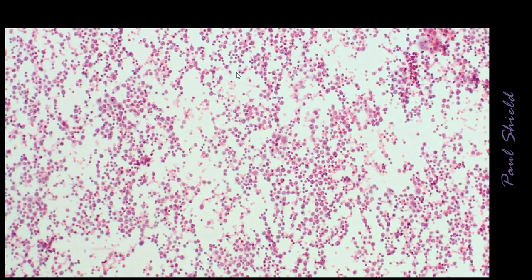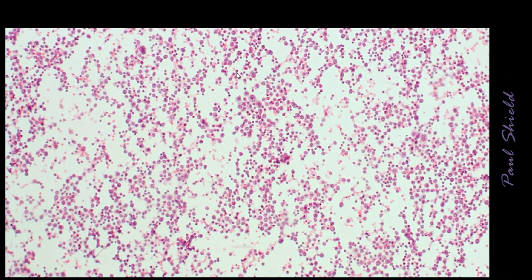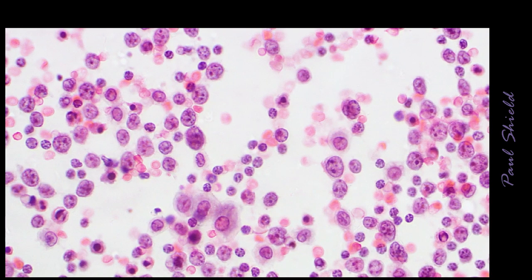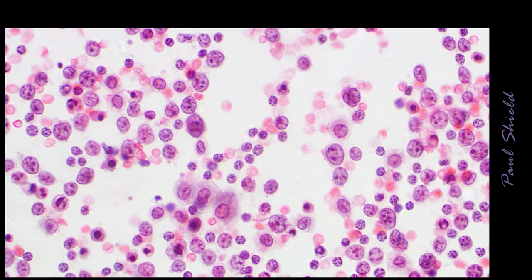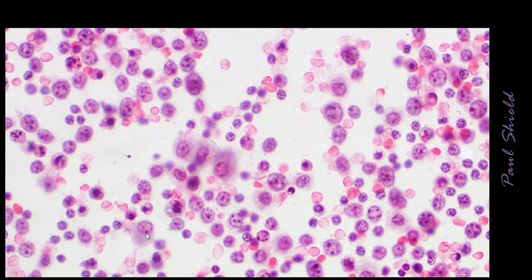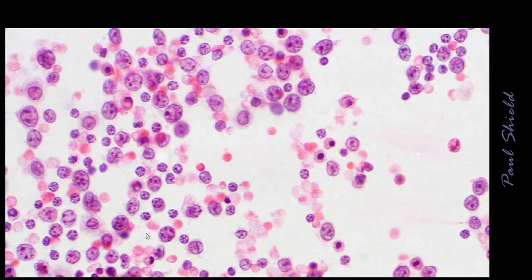This is the PAP, and as usual with lymphomas it's not as useful, but again I can see a dispersed population, so that's reassuring for a lymphoma. The nuclei in high power have quite a lot of nucleoli, which is sort of a variable thing in lymphomas. There's some mesothelial cells there, some more down here. And again I can see really what looks like almost two populations of cells. These are mesothelial, with smaller, more mature lymphocytes there.